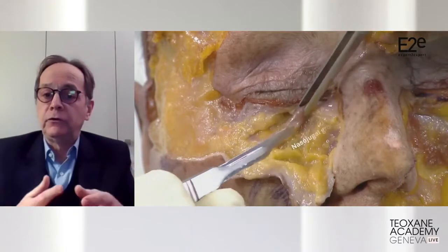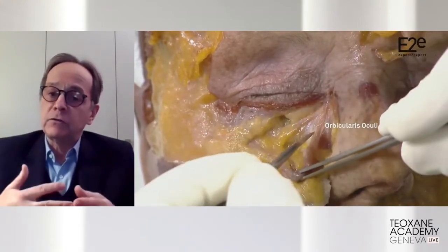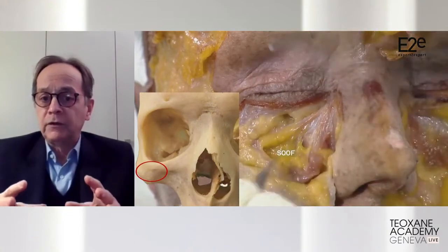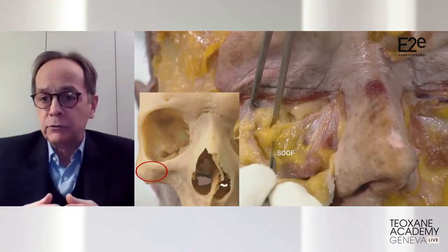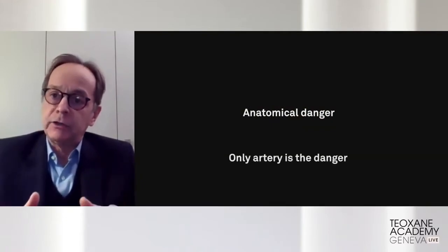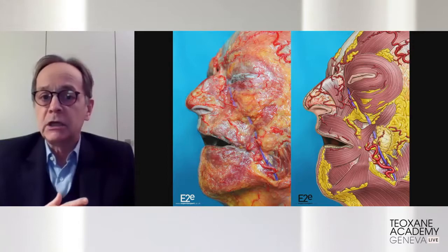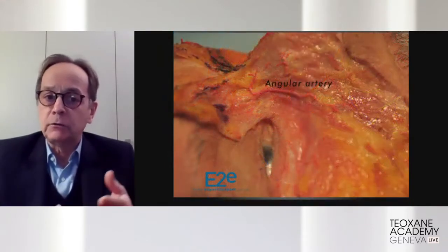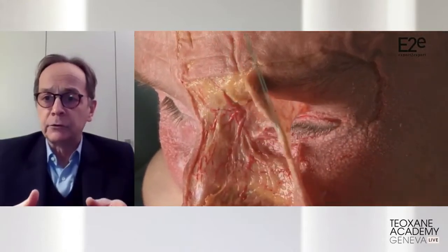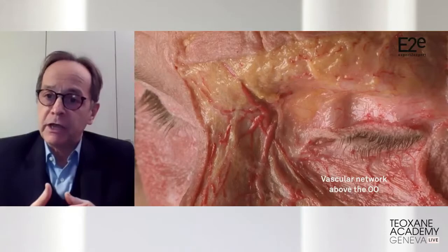If we go after that to the nasojugal groove that is just under the tear trough, it's very important to understand that the nasojugal groove is the dangerous area of this infraorbital hollow, because in the nasojugal groove, you have the path of the angular artery. And the angular artery is the only danger of this area, not for the tear trough injection. The angular artery is the terminal branch of your facial artery and is superficial to the orbicularis oculi. But it's not going in the tear trough. It's coming in the nasojugal groove and then it's going on the lateral side of the nose. So normally, far away from your injection in your tear trough.